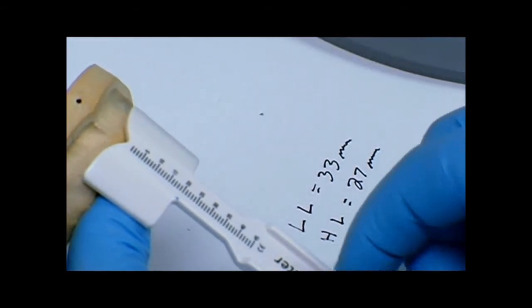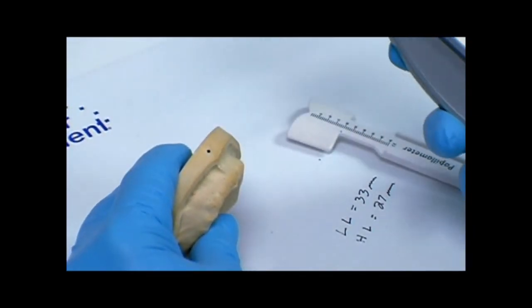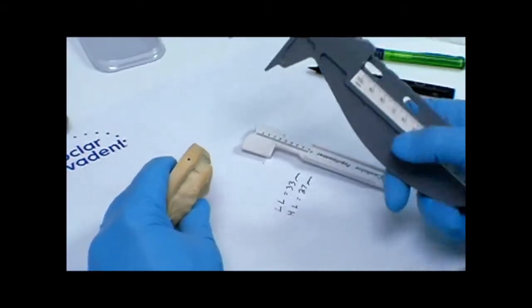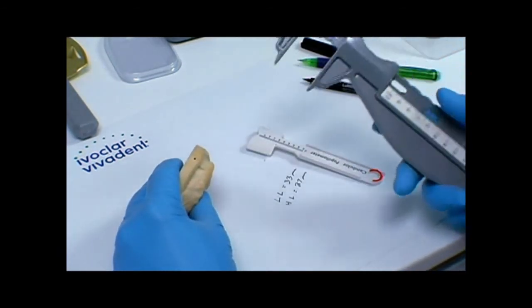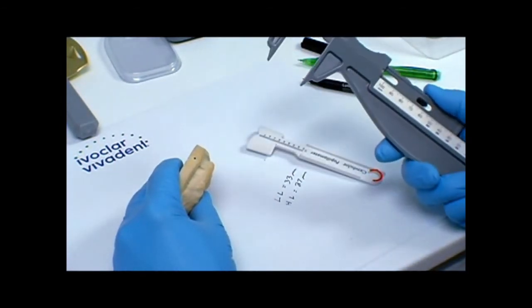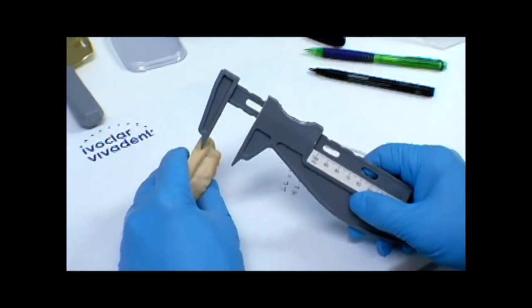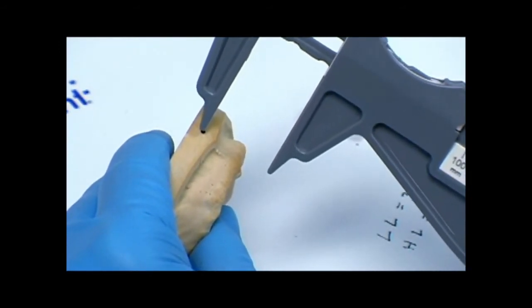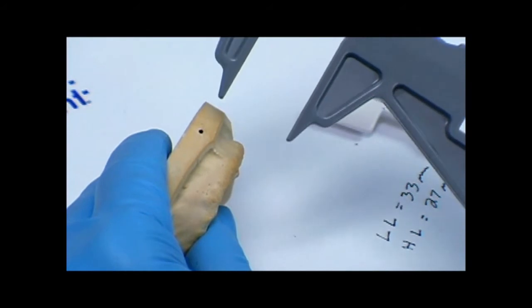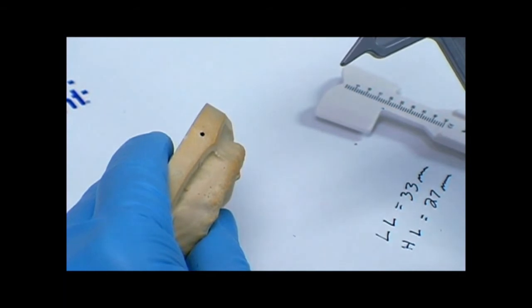So when the laboratory is ready to fabricate the wax rim, they'll preset this to 33 millimeters. And then when they fabricate the wax rim, they'll make the wax rim at that particular length. And then when they're ready to do the setting of the teeth and they want to do their final wax-up, they'll preset this to 27 millimeters. And they'll make sure that the gingival wax-up covers at least that much of the tooth structure. So it's a nice means of communicating some of this personal or clinical criteria to the laboratory to help in the process of setting teeth as well as the wax rim length.